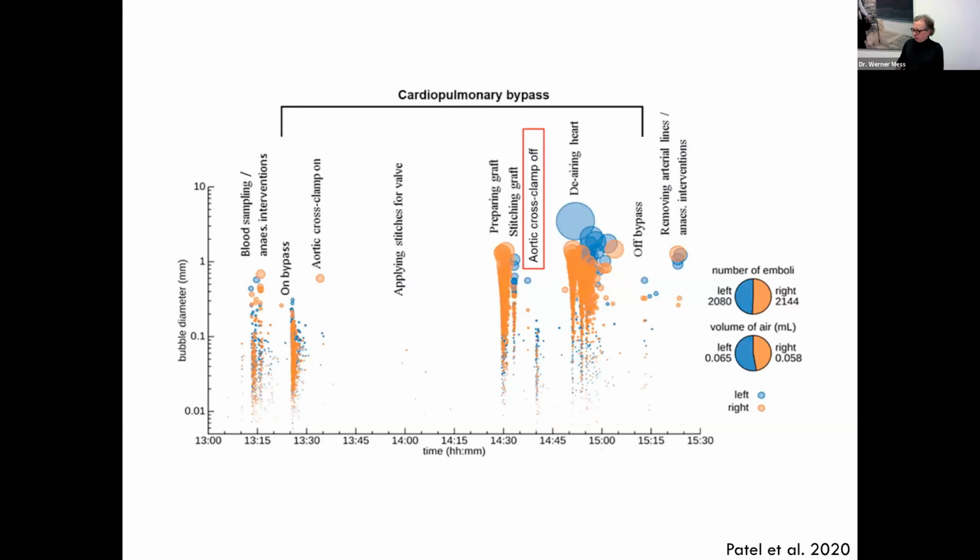So I wanted to go back to the slide, and here it is again. So why am I showing you this again? These authors did pre- and post-operative MRI of the brain. And there were new lesions indeed, but these new lesions were only correlated to these emboli.